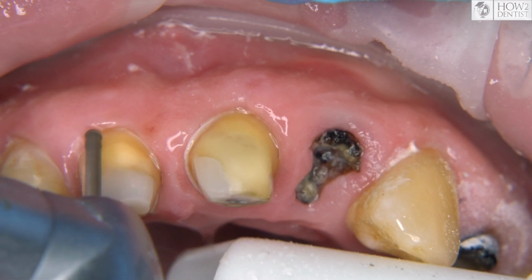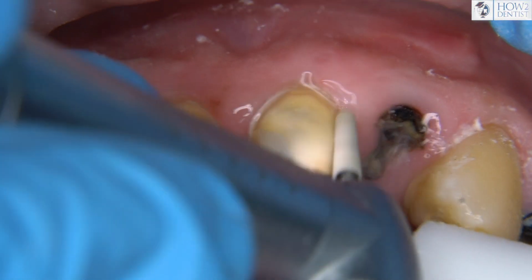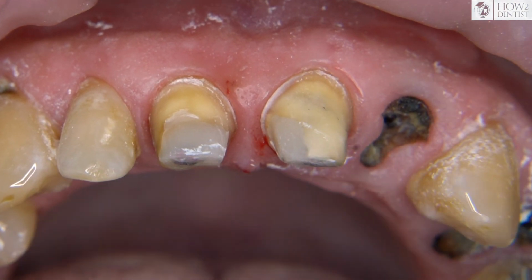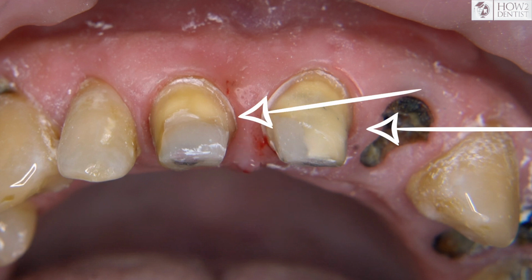After the stumps are restored, we start to prepare them, so that the material for the temporary crown does not adhere to the stump of build-up core material. It should be well polished or insulated with petroleum jelly. In this case, the preparation margin does not descend under the gum, and it's possible to make a restoration with a good fit without putting retraction cord or any additional manipulations.